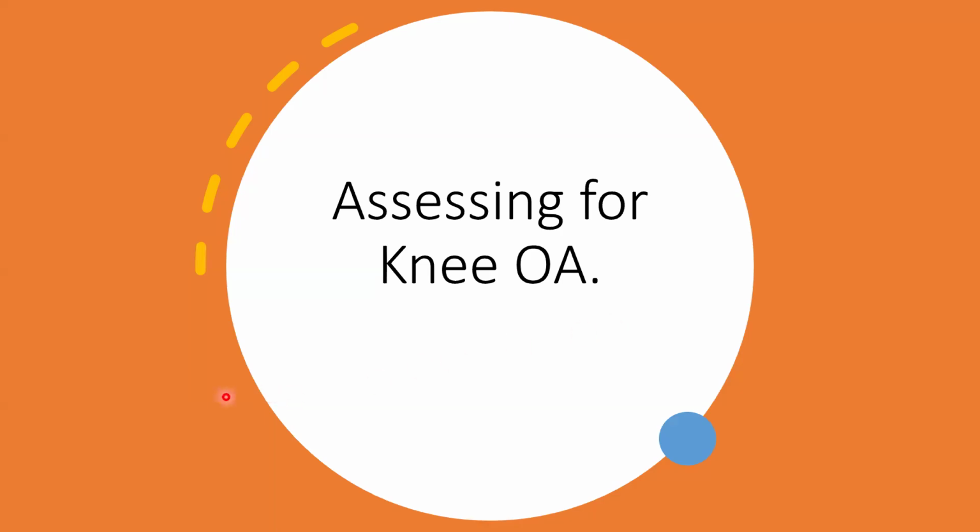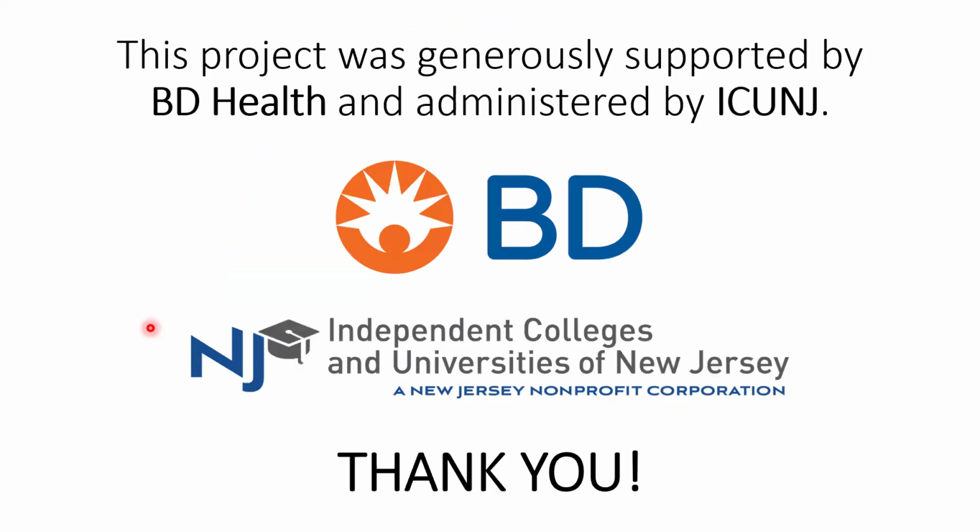Hello and welcome to the third and final video in our series on using the ultrasound for assessing knee OA. In the first video, we went through the basics of OA and some of the recent literature. In the second video, we talked about the ultrasound scanner and fundamentally how it works and how we use it. In this video, we're going to put those two things together and talk specifically about using the ultrasound to help us assess knee OA.